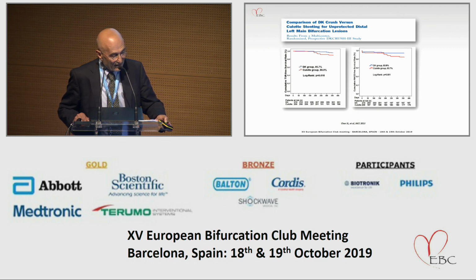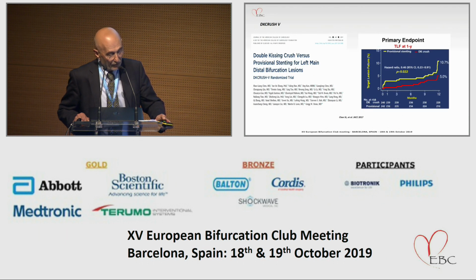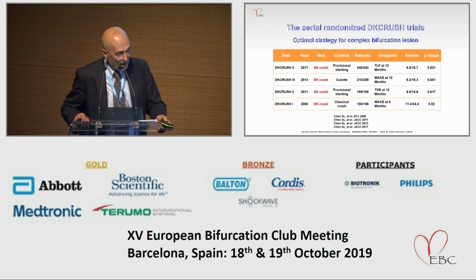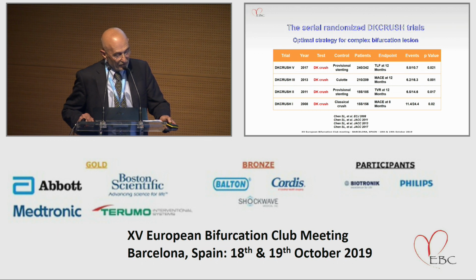superior to Culotte stenting in the DK crush study again, and versus even provisional stenting. This is the series of DK crush trials: DK crush 1 versus classical crush, provisional stenting, Culotte, and again provisional stenting.